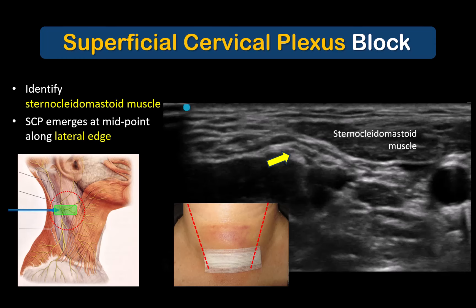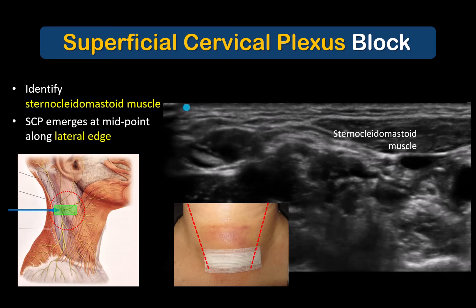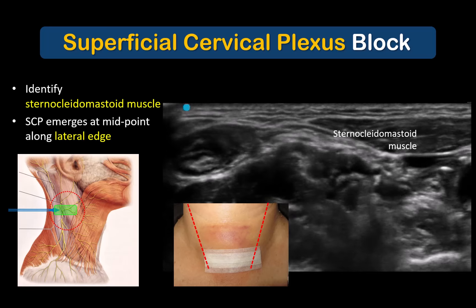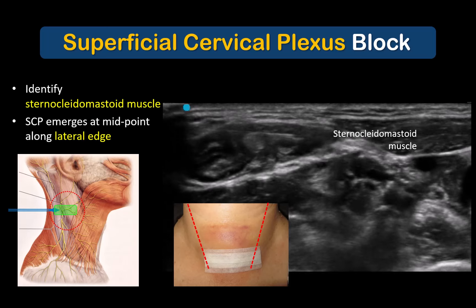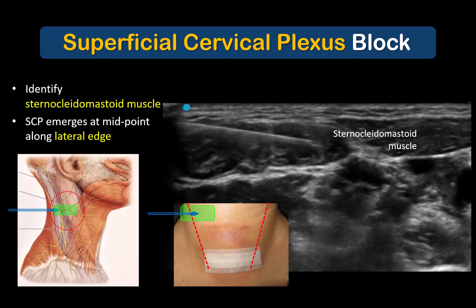There is a fascial space underneath the edge of the sternocleidomastoid muscle which contains small structures that, if you scan up and down the neck, will be seen to spread out laterally from under the muscle into the subcutaneous tissues. 10 milliliters of local anesthetic injected into this fascial space will block the superficial cervical plexus and produce sensory loss over the anterior neck and cape of shoulder, but will also cause numbness of the jaw and ear, which is worth mentioning to the patient.